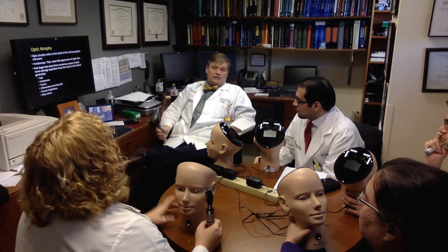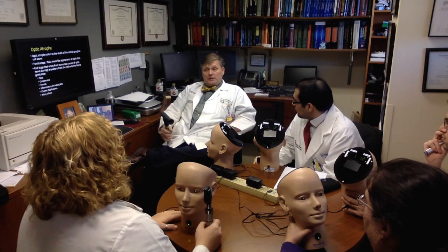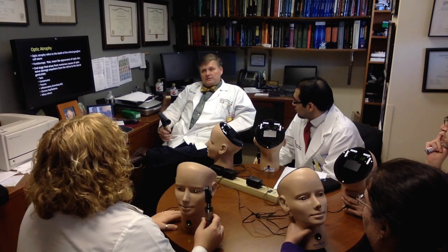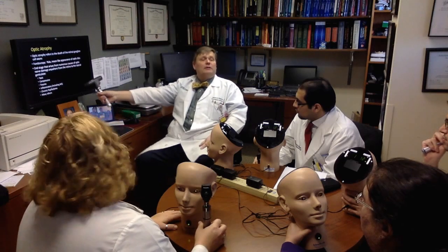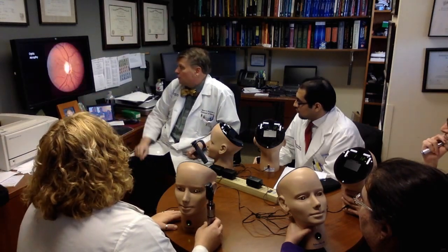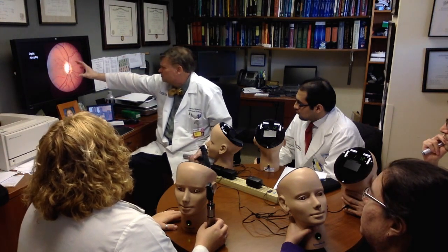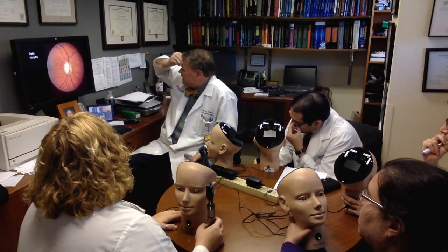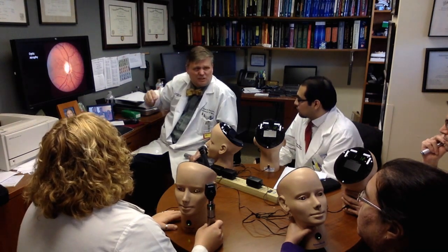So someone said, gee, I had this spell 5 years ago where I lost vision in the eye, I came back over 2 months. You look at the fundi, and boy, that disc is really pale compared to the other one, okay? For the sake of argument, if you have chronic papilledema, that can cause optic atrophy. So here's optic atrophy, where it's like, boy, it just looks like a pale moon. Where does the cup end? Where does the disc start? It's not clear at all.